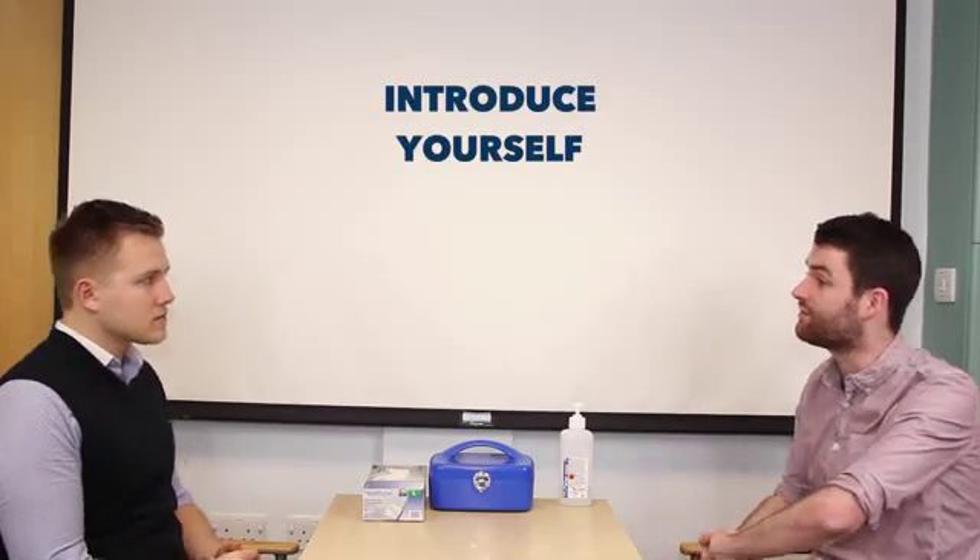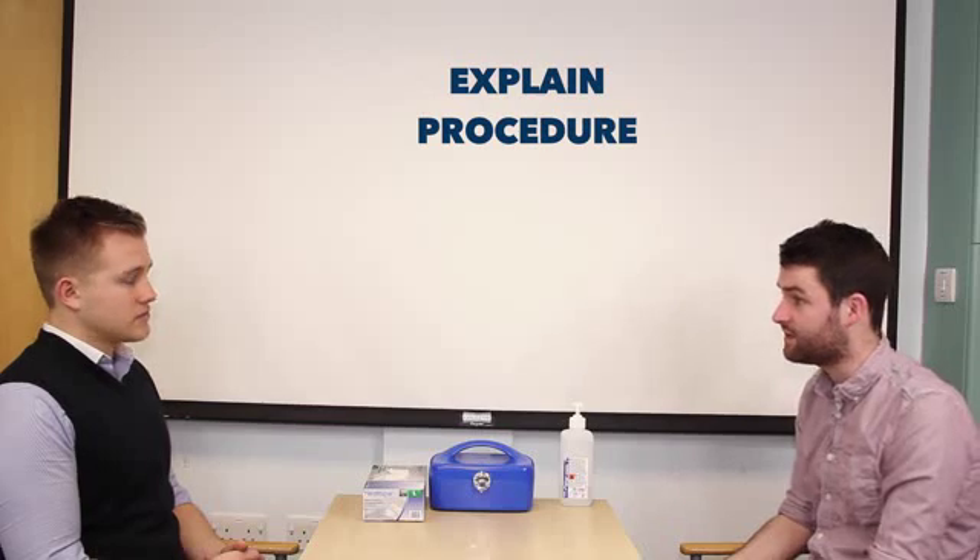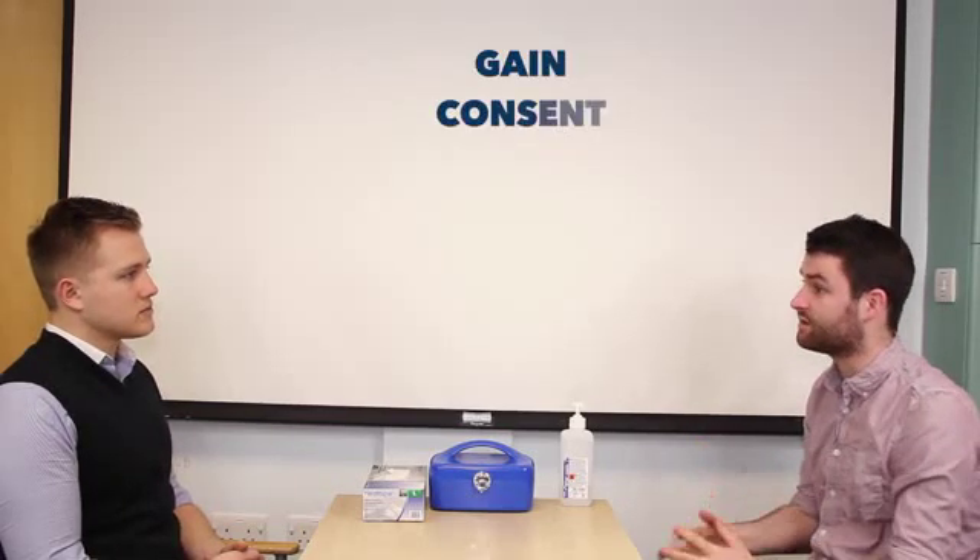Hi, my name's Simon. I'm one of the final year medical students. Can I just check your name and age please? Yeah, it's Andrew and I'm 25. So today I'd like to check a blood sugar reading if that's okay. That'll involve me taking a small blood sample from the end of your fingertip. Does that sound alright?